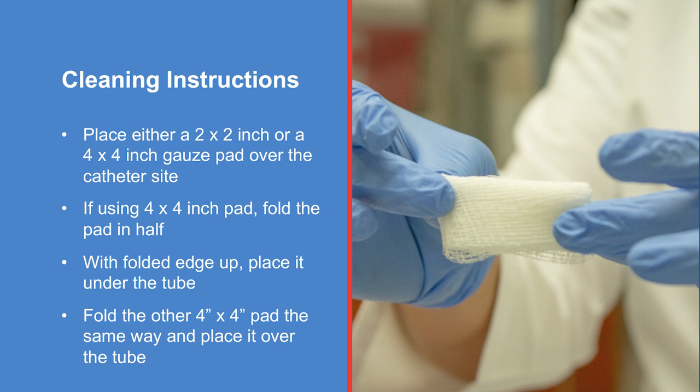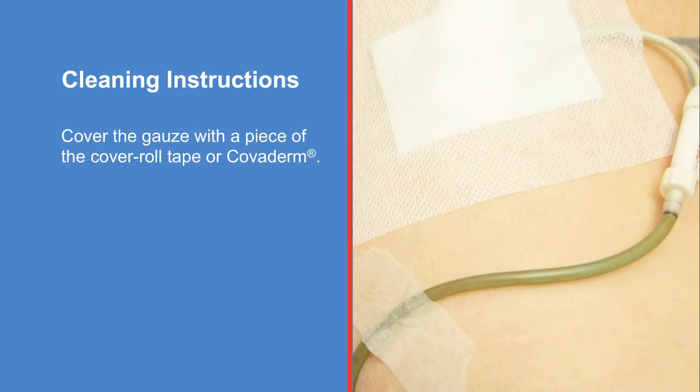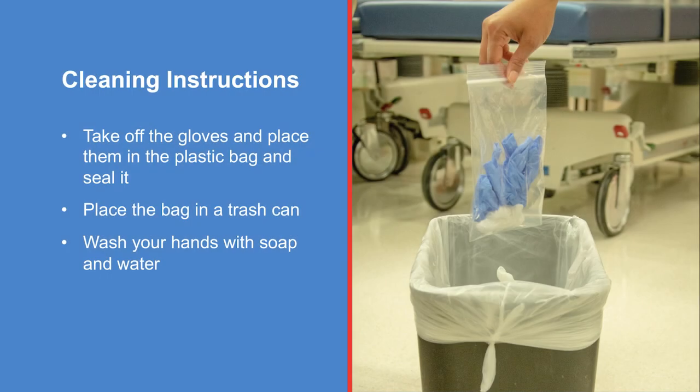Place either a two inch by two inch or a four inch by four inch gauze pad over the catheter site. If using a four inch by four inch pad, fold the pad in half. With the folded edge up, place it under the tube. Fold the other four inch by four inch pad the same way and place it over the tube. Cover the gauze with a piece of the cover roll tape or Covaderm. Take off the gloves and place them in the plastic bag and seal it. Place the bag in a trash can, then wash your hands with soap and water.